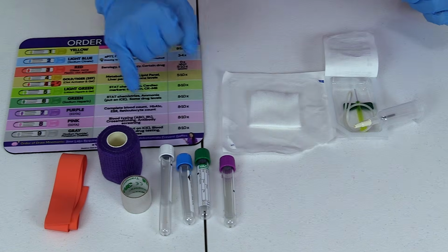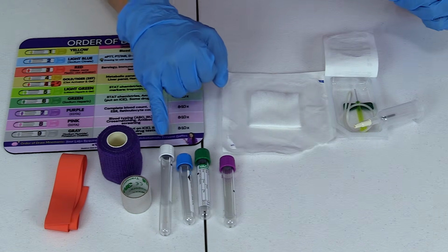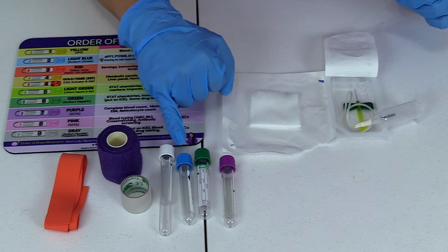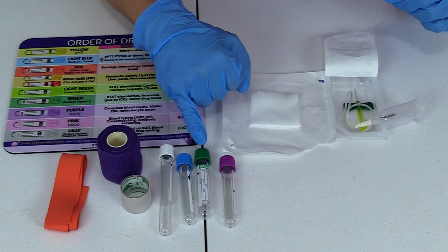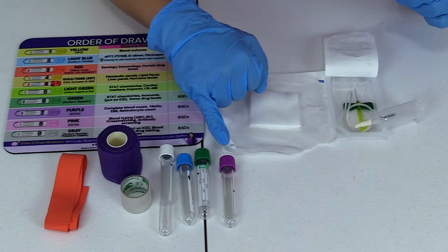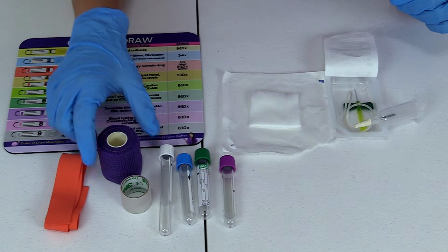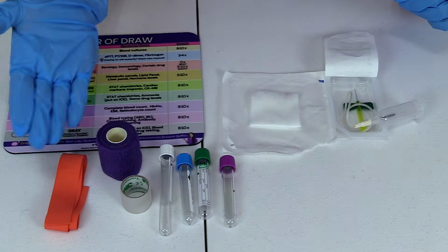So get the tubes that you need and go ahead and put them in the order of draw based on whatever's ordered. So I'm going to be doing a waste tube in the white top. Then followed by that, I'm going to do my sodium citrate, the light blue. Then I'm going to do my green, the lithium heparin, and then the lavender, also called purple, with the EDTA. And I'm going to have Coban ready, or tape, whatever the patient prefers.